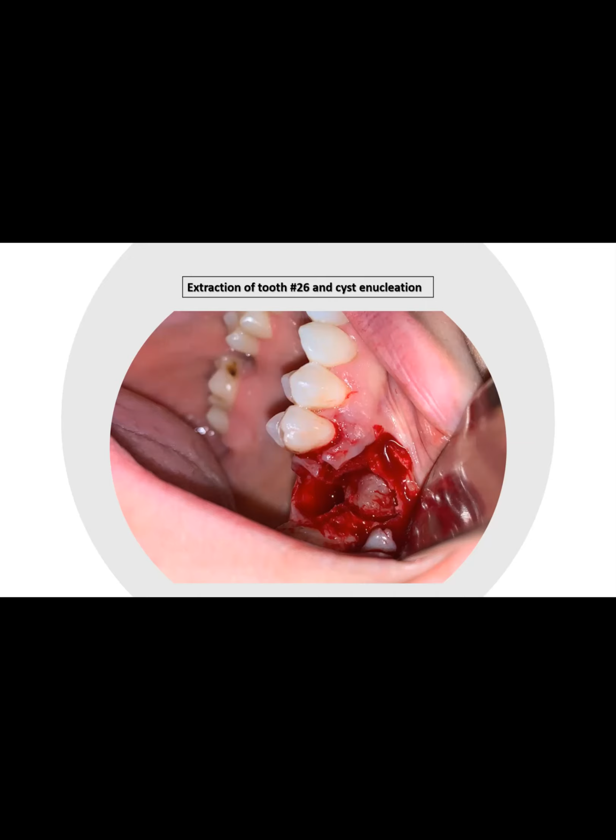Now, would you graft or you wouldn't graft, Dr. Ali? Are we going to do an implant there? Yes, she's a hygiene student and she would love to have an implant, and that's why she was referred to see me to start with.